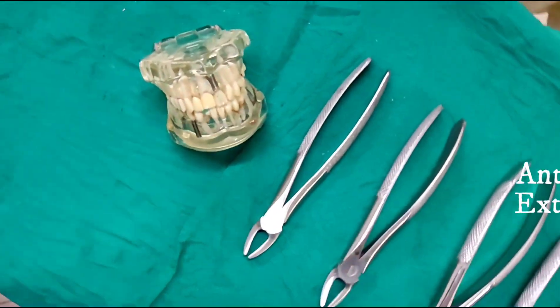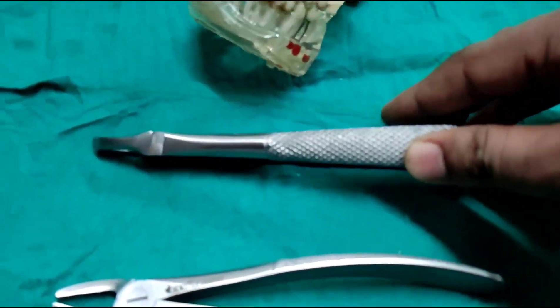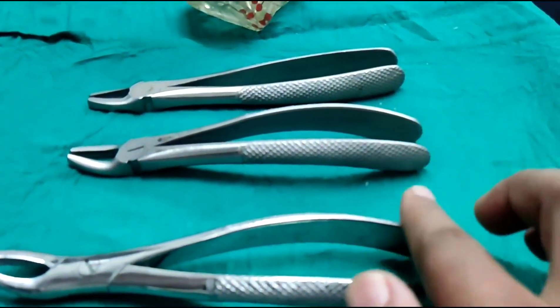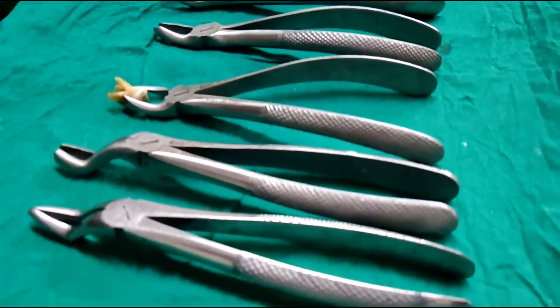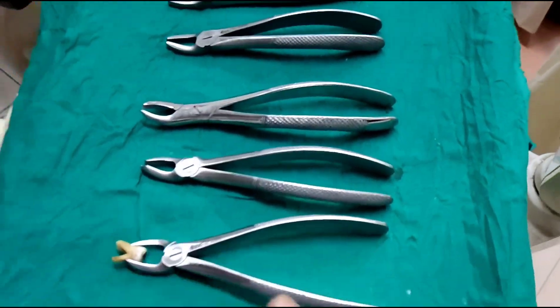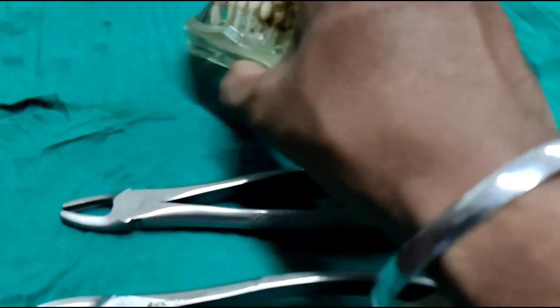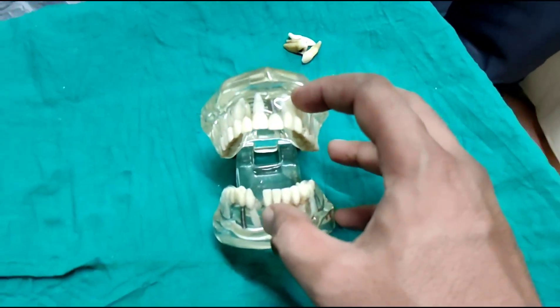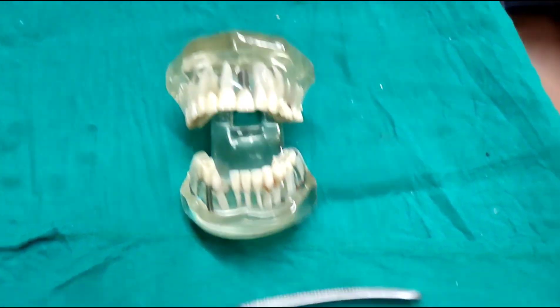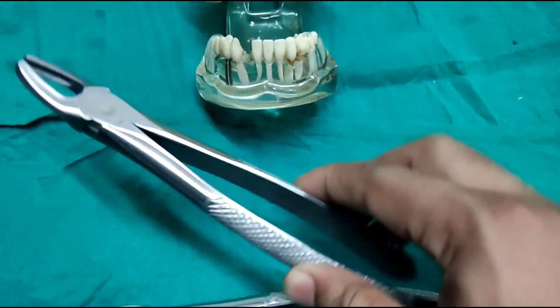Coming to the anterior forceps or the incisor forceps — we can see that the anterior forceps is straight. In comparison, the premolar forceps is curved, the molar forceps is curved, and the third molar forceps and all other maxillary forceps are curved. This helps in giving proper access and hold. But the anterior forceps is straight because the maxillary anterior teeth are easily accessible and in the front, and this gives us proper positioning.